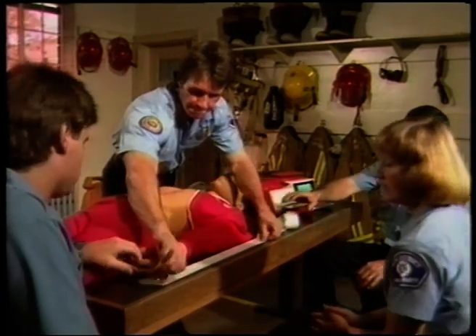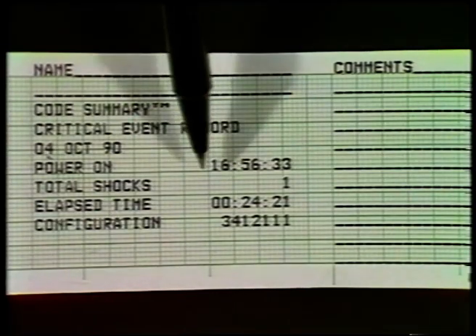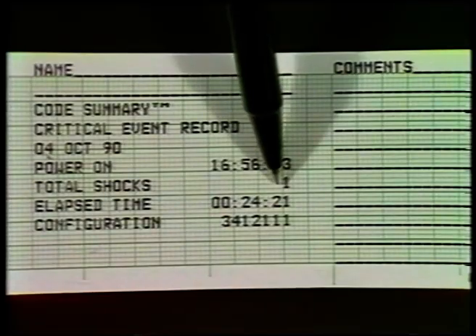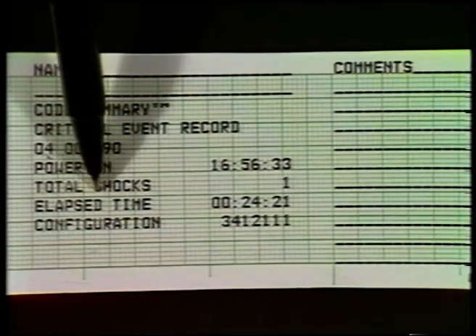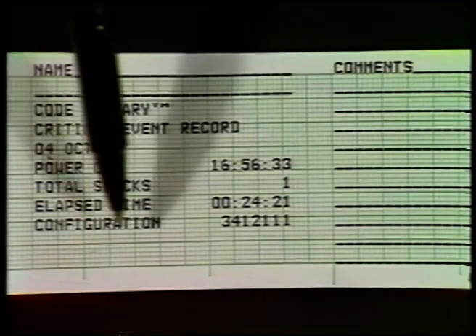This is the Code Summary Critical Event Record format. The first section is an overview. There's a space to write the patient's name, and here is the date and time power was turned on. The total number of shocks delivered is next, followed by the total elapsed time from when the unit was turned on to when Code Summary was printed.